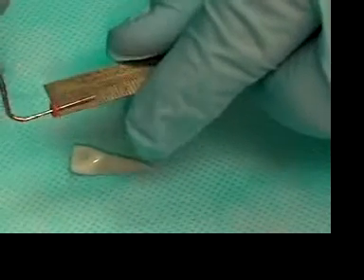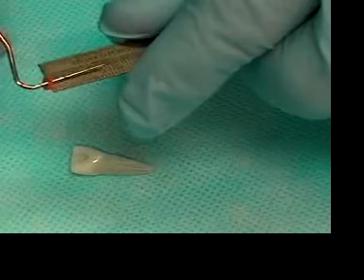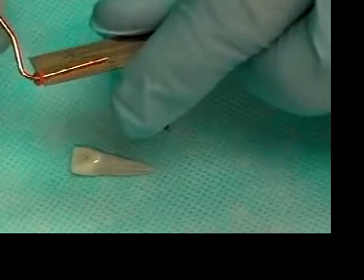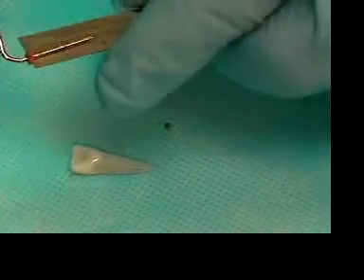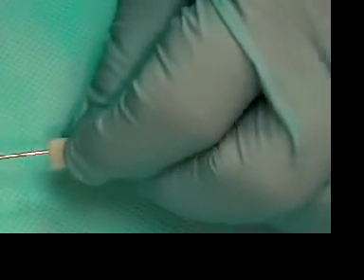I'm going to set this at 18 millimeters. When we put this in the canal, you see that there's quite a discrepancy — it's not even going close to what our ideal length is, 5 to 7 millimeters from the working length.